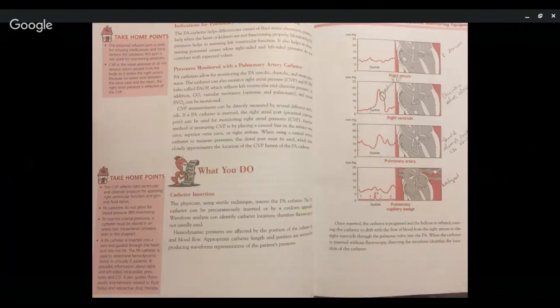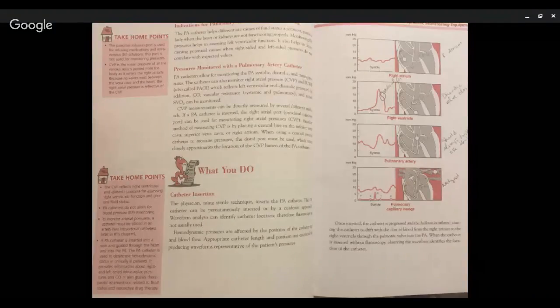A PA catheter is inserted into a vein and guided through the heart and into the PA. The pulmonary artery catheter is used to determine hemodynamic status in critically ill patients. It provides information about right and left-sided intracardiac pressures and cardiac output. It also guides therapeutic interventions related to fluid status and vasoactive drug therapy.